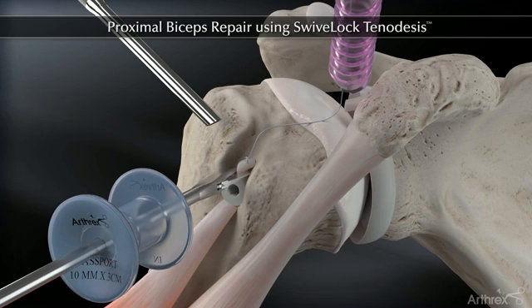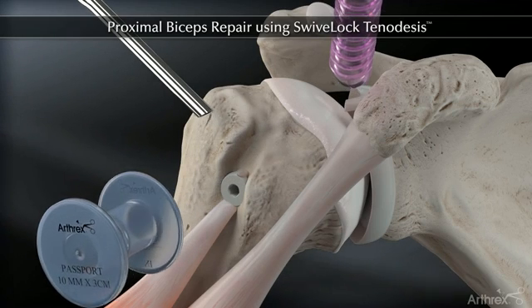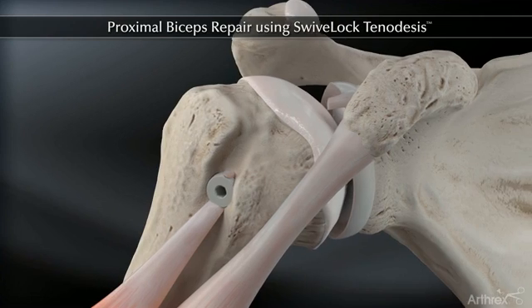Trim the excess tendon, completing the knotless repair.